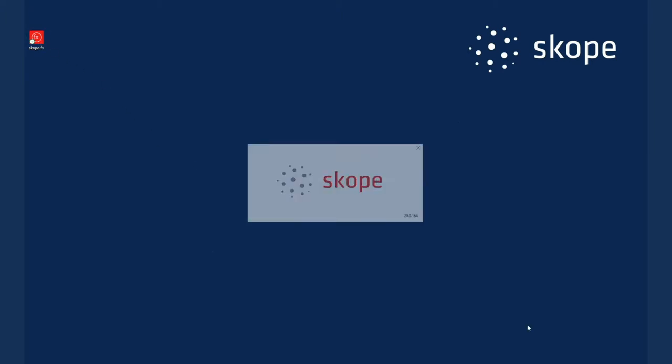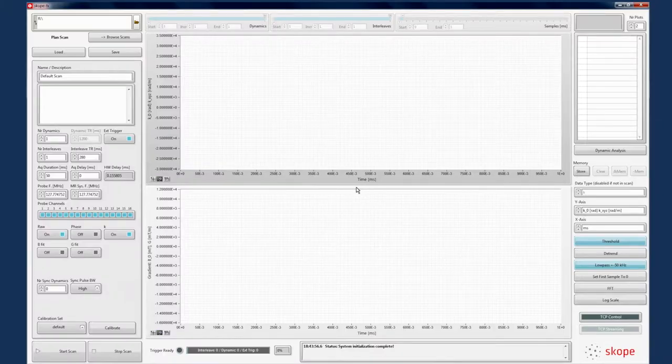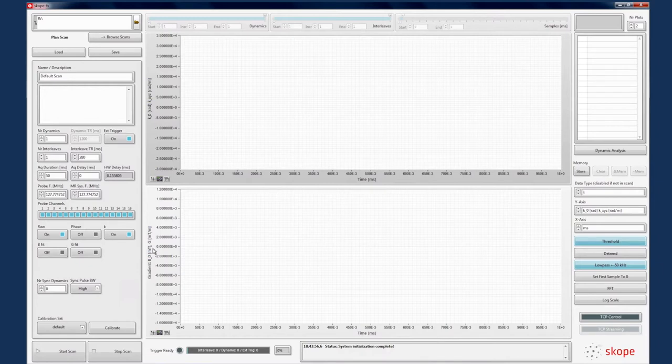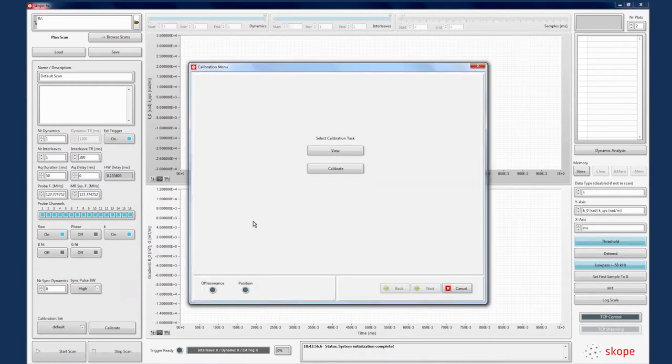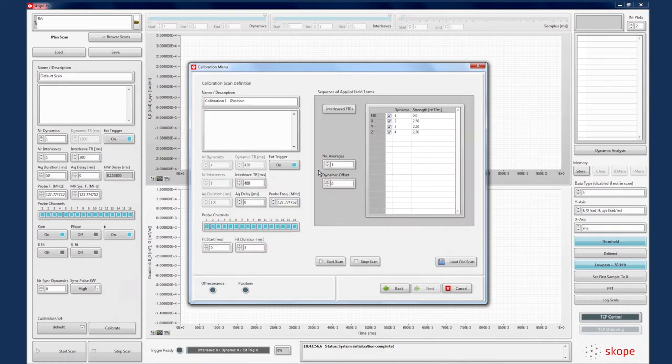From the acquisition system side, calibration is started by launching Scope FX, the software responsible for operating the acquisition system and interpreting the results. By pressing calibrate, the calibration window pops up. Here we choose to do a new calibration which then allows us to set the parameters to match a specific calibration sequence. We then press start scan and wait until the system is ready.